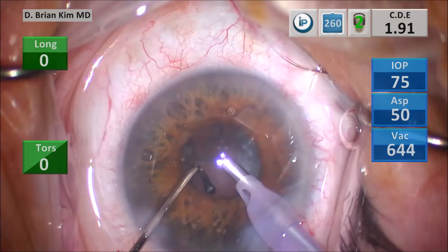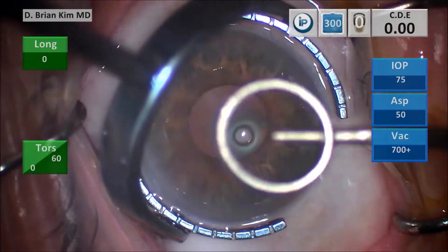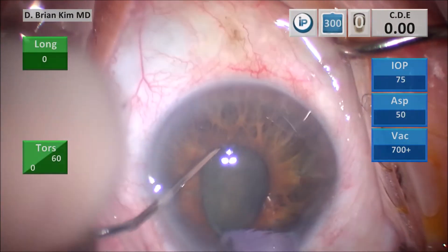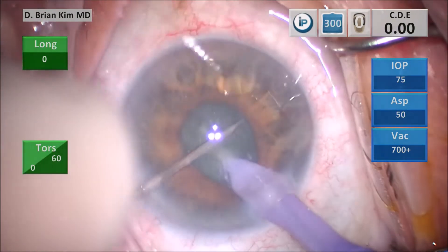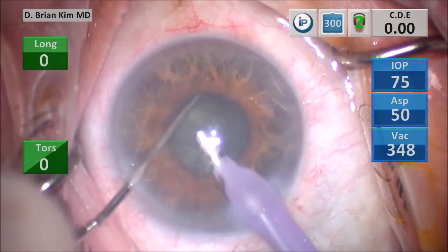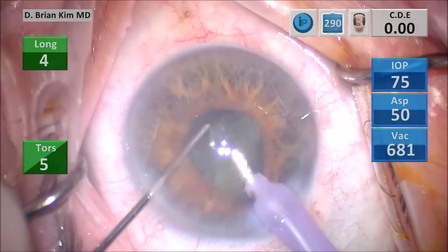By using mechanical forces you don't have to worry about accidentally grabbing something you don't want to, and you're working in the central safe zone the entire time. It's a matter of staying consistent and keeping your instruments right in the middle. Whether it's a big pupil or a small pupil, it doesn't matter — you're able to continue the technique, chop the lens into small pieces, and just feather the pedal and emulsify the lens pieces as you go.